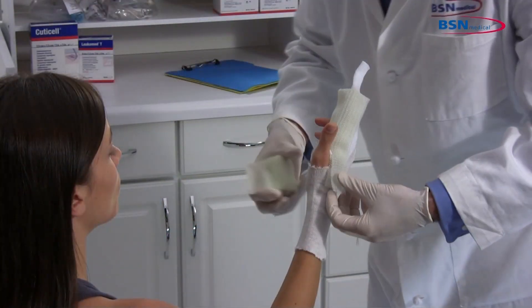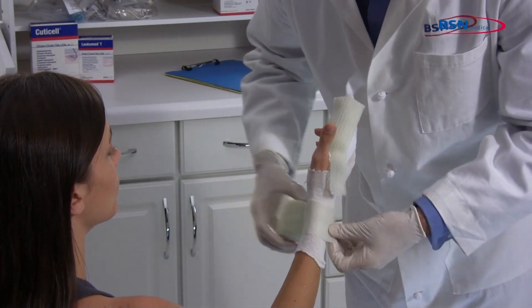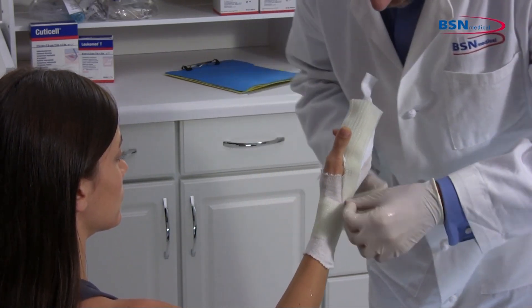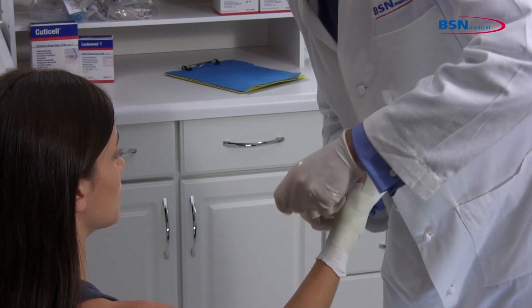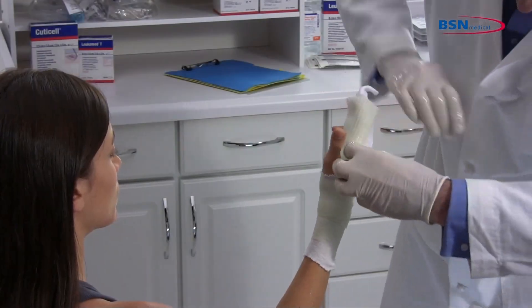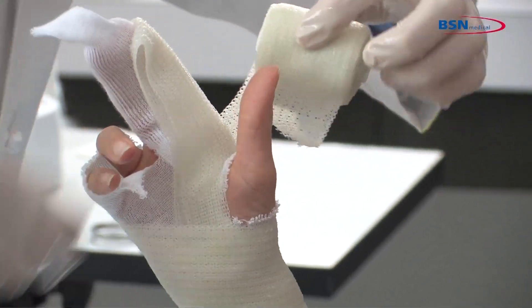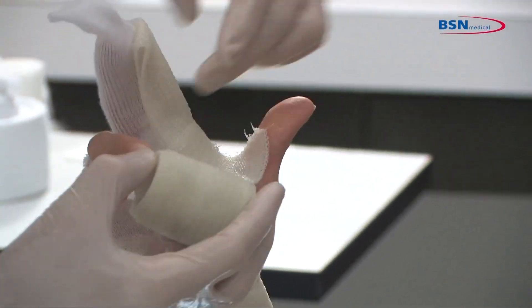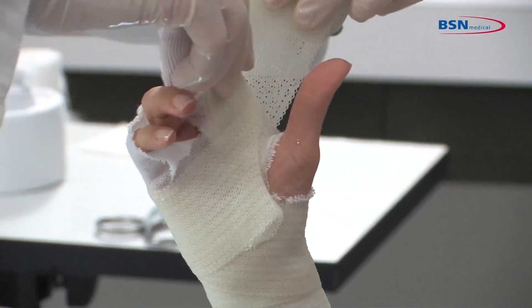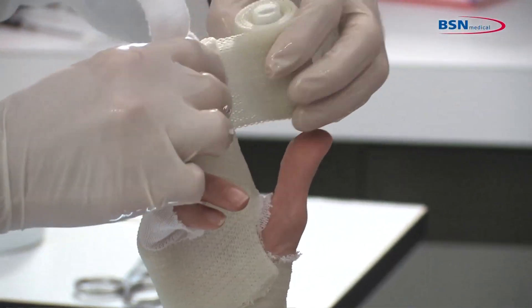Dip the cast tape in water, squeezing one to three times. Remove from water and squeeze one time to remove excess water. Start wrapping the cast below the wrist and make a cut to go through the web space. Work around the second and third phalanges twice, then cut the cast tape.